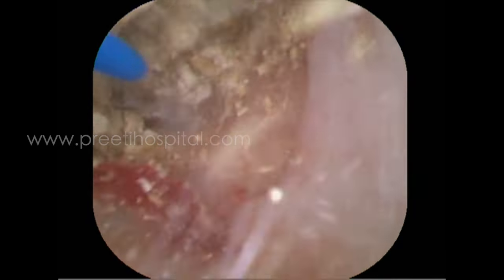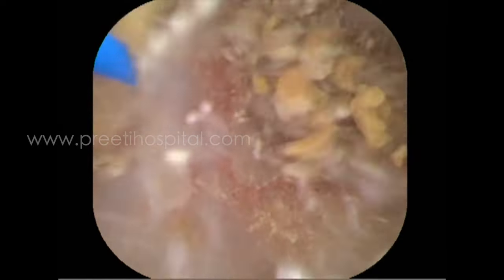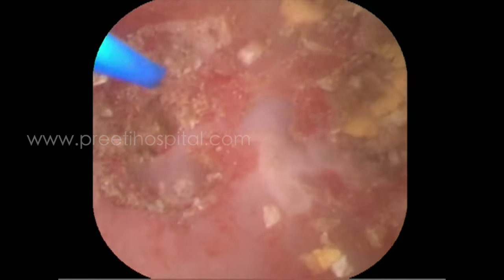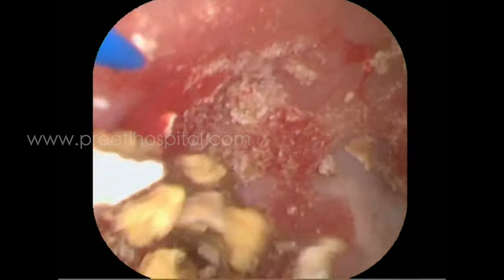These procedures have been done over the last 6 months, and many senior people are adapting to this procedure. So I attempted a large volume stone after a long time. See, these are all fragments. Normally you have to do popcorn, where temperature will rise. Here I am using popcorn but with suction, which means the water is coming out immediately the moment it gets heated up. The entire upper calyx bifid system is getting cleared.